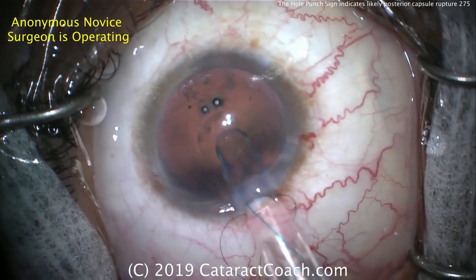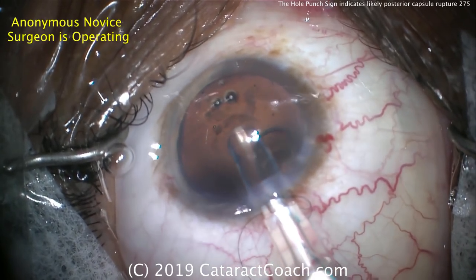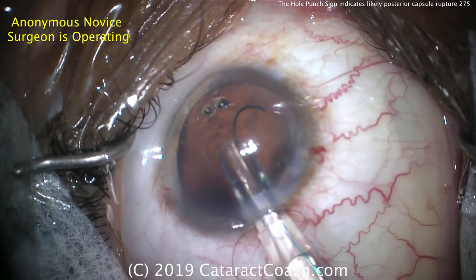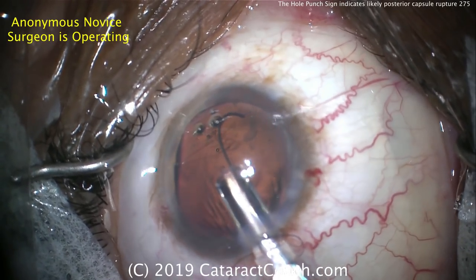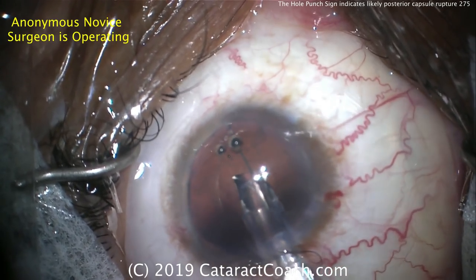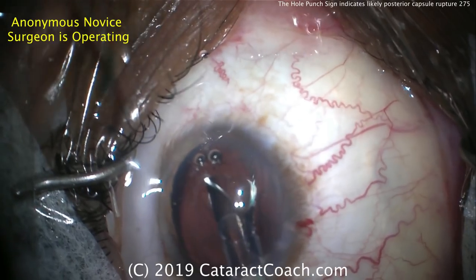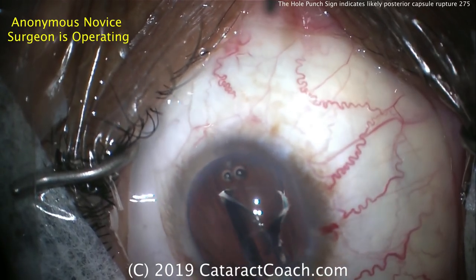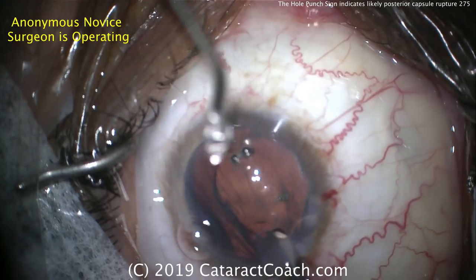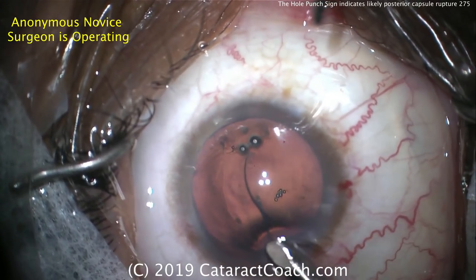You obviously cannot place a single-piece acrylic lens in the sulcus. The first haptic is coming out — we all know that's the wrong orientation. What do we want? It should come out like a number seven. Let's rotate that over. We don't want it in that orientation. Remember: 7L — the first haptic should come out like a number seven and the trailing haptic should come out like a capital letter L. When you look at the lens as a whole, it should certainly not look like the letter S. This orientation here is correct — that looks great.